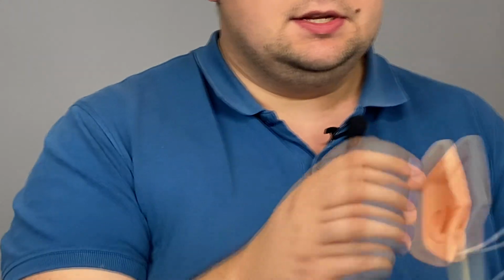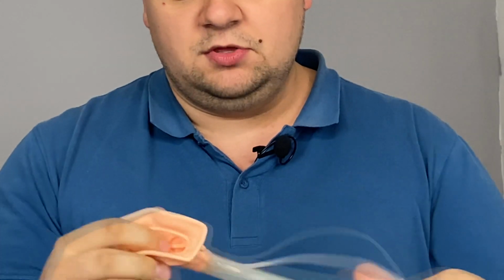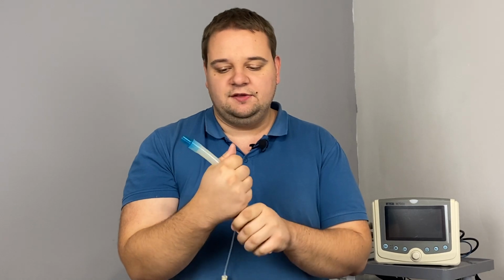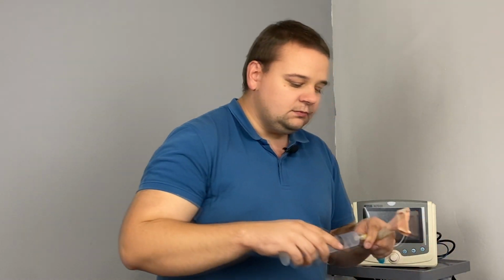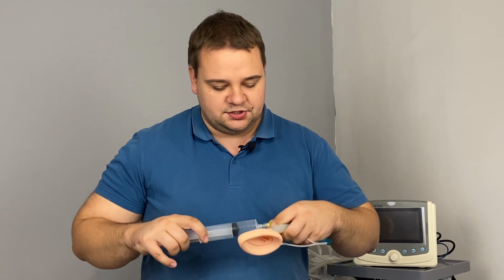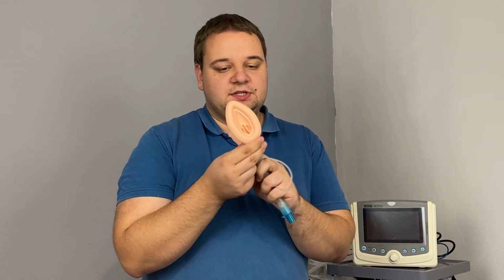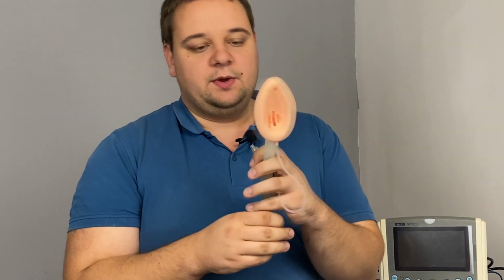So you must deflate everything before you install it in the patient. Then this will be the inside part, and this is the connector from the outside. You also push it deep down in the patient, as deep as you can, so you will be left with something like that coming out of the patient. And then you inflate the cuff. When you do that, you will also see the outcome generally the same as before, as in the laryngeal tube. So this part will seal off the esophagus, this part will seal off the mouth, and this is the exit part for the air, so that the air will come inside the airway of the patient.